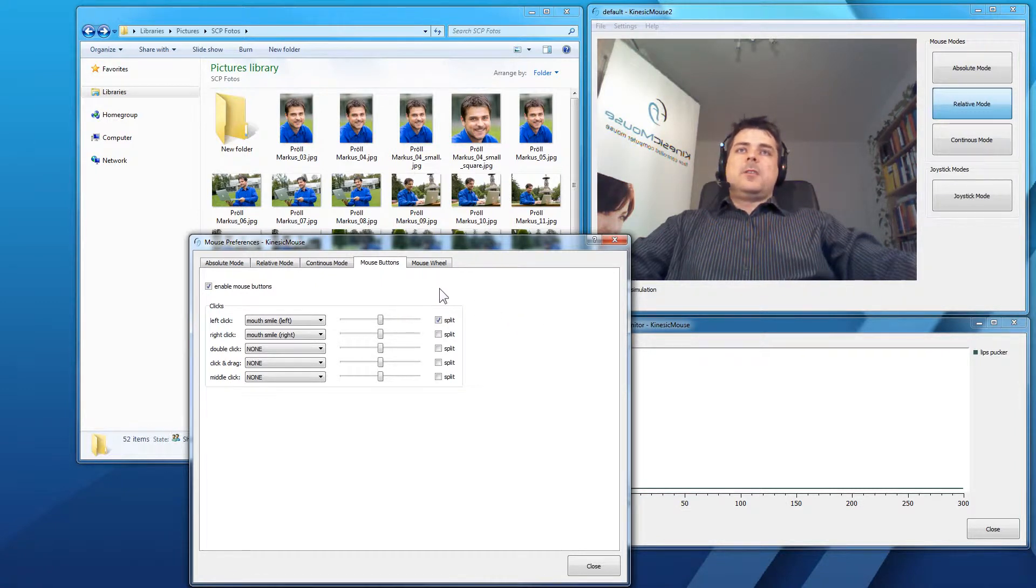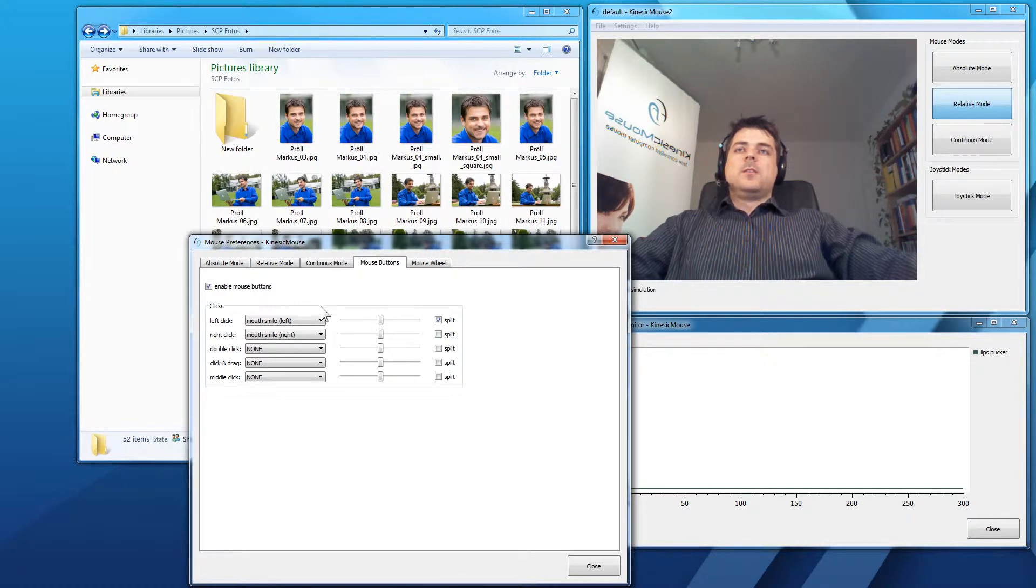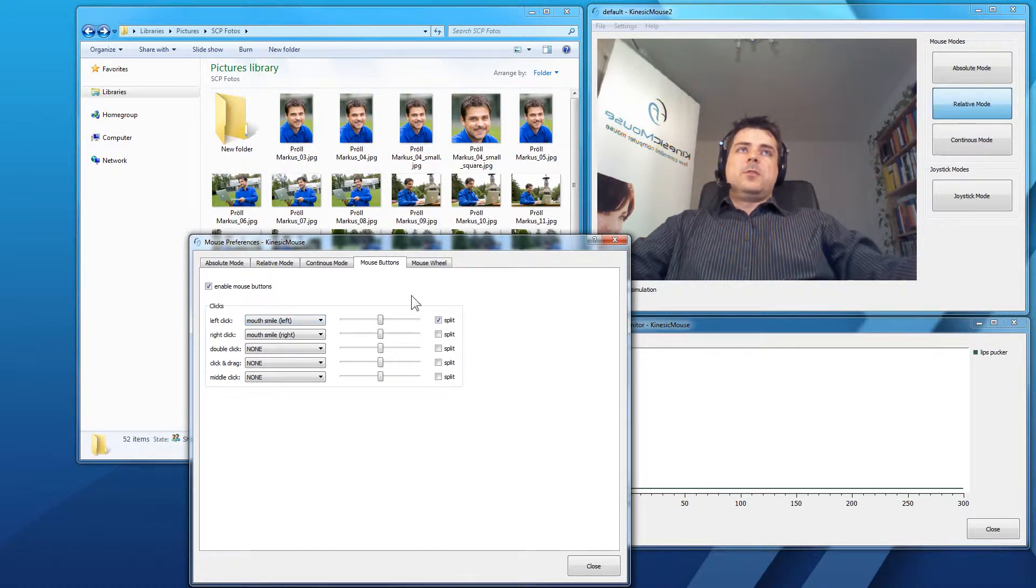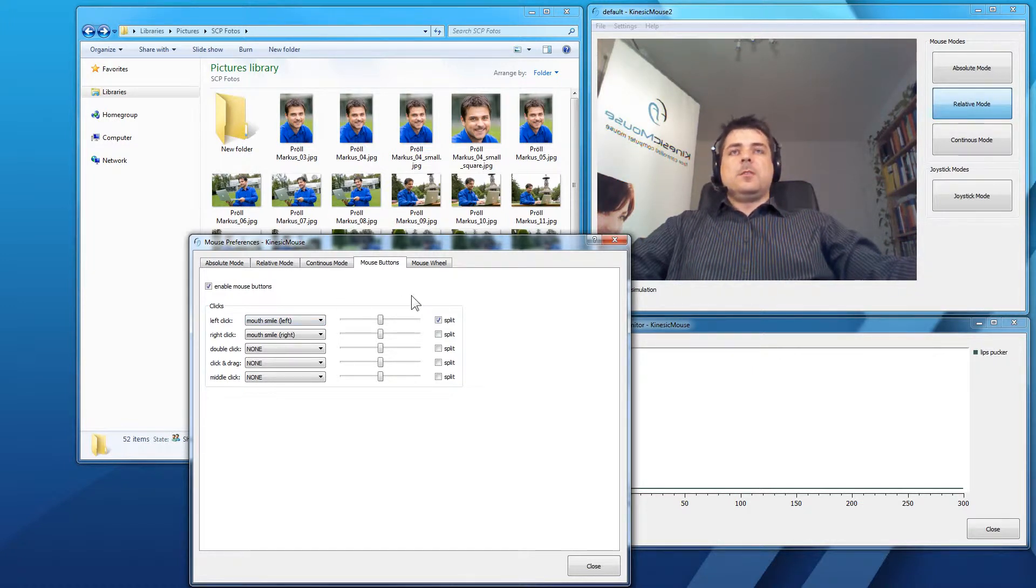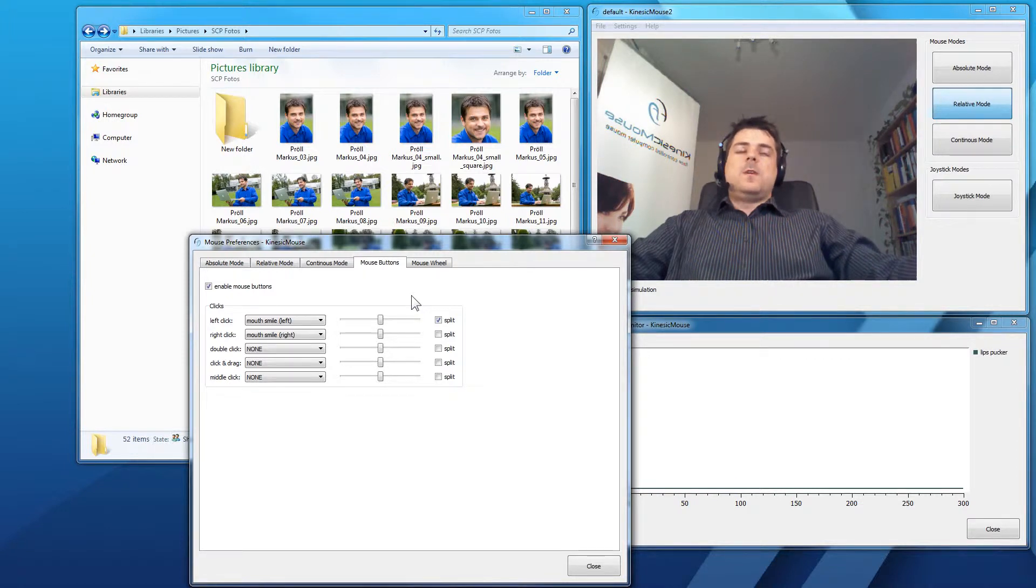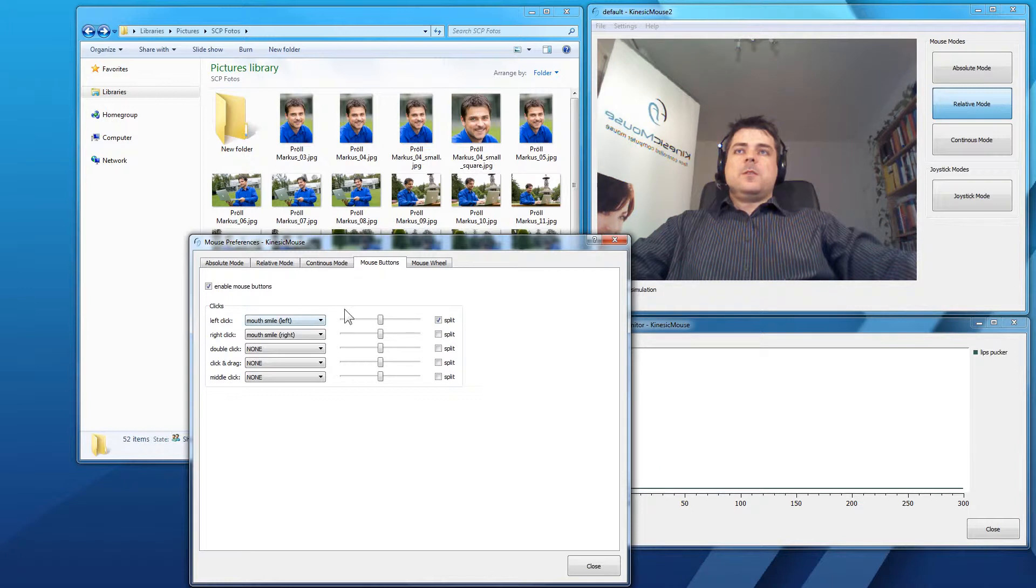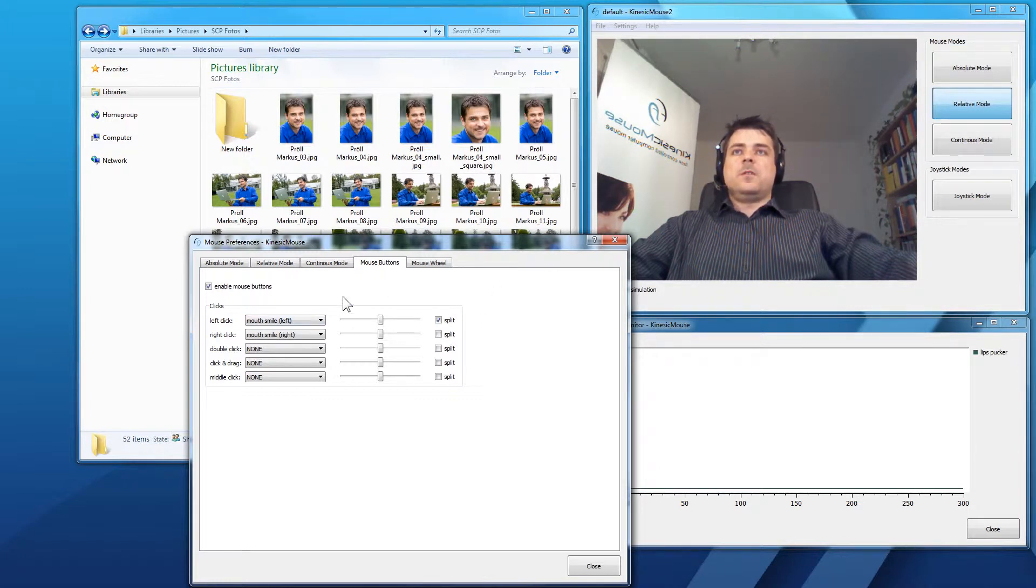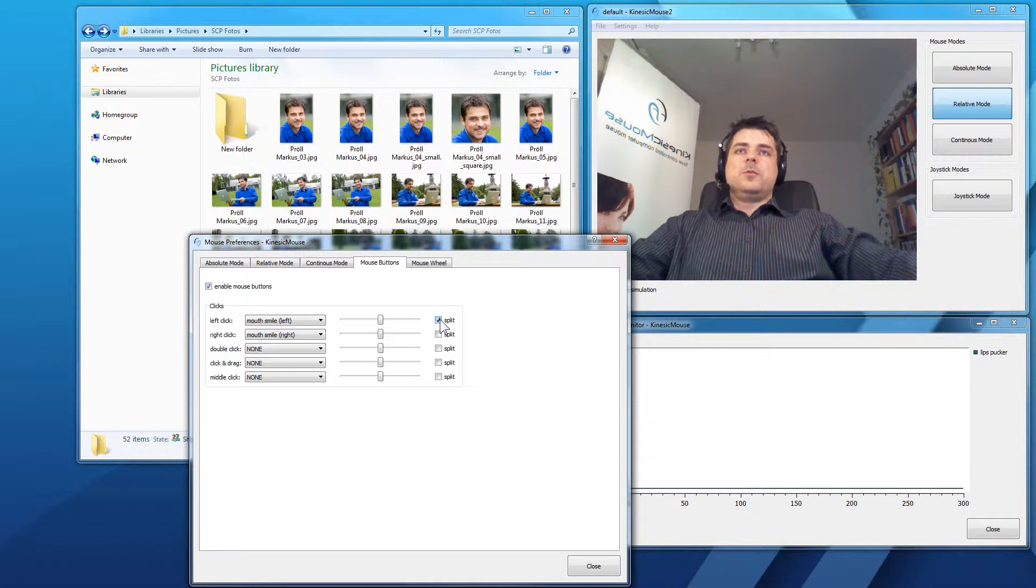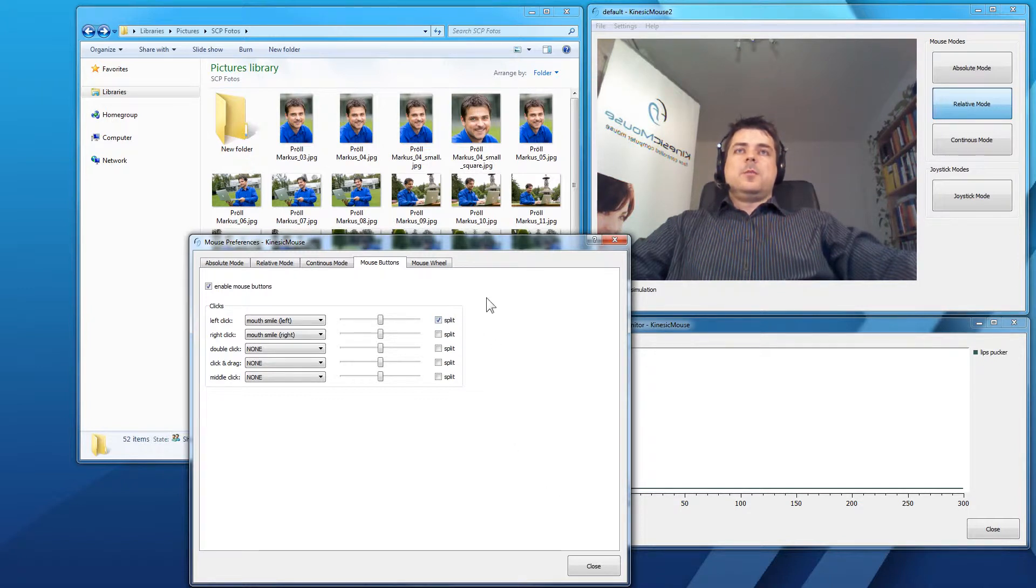But, the downside to this is that your normal left click will also have this holding down of the mouse button while you perform this expression. So, if you have a good signal right here and you are confident with your left click, you can also use the split here to perform the click and drag.